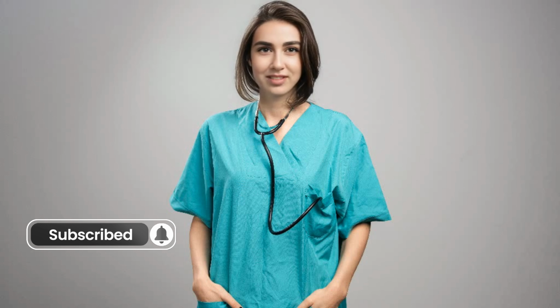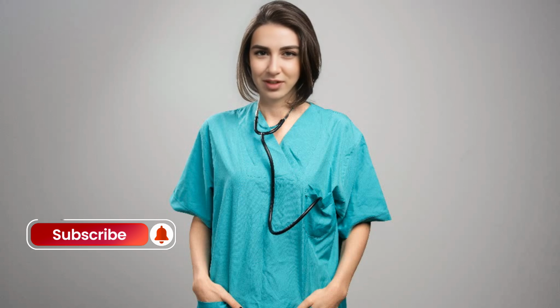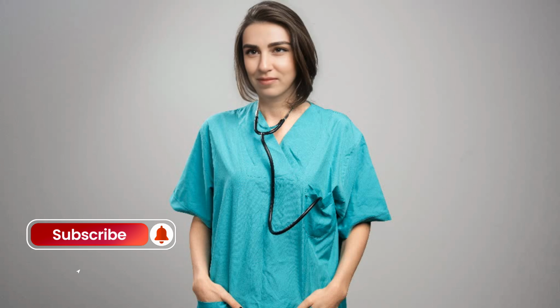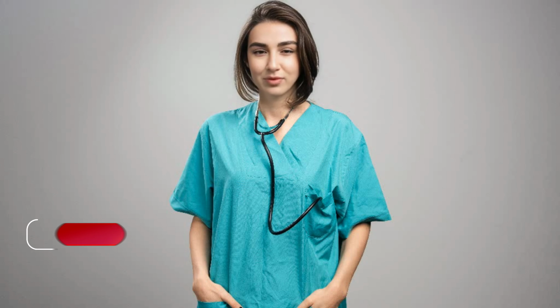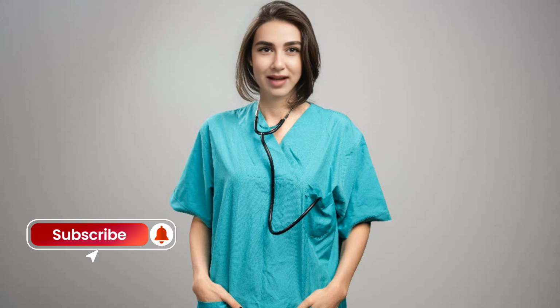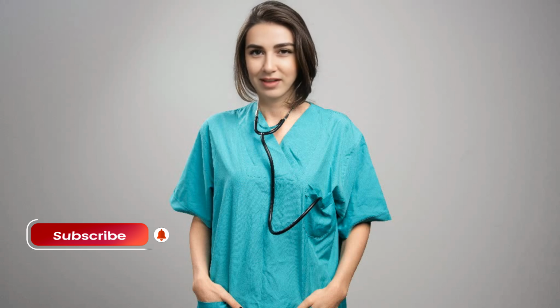Facts about angioplasty. 1. Purpose: angioplasty helps restore blood flow to the heart by widening narrowed or blocked arteries. 2. Minimally invasive: unlike open heart surgery, angioplasty is less invasive and often involves just a small puncture in the skin. 3. Catheter-based: the procedure relies on a catheter, a thin, flexible tube, to reach the affected artery. 4. Balloon and stent: a small balloon is inflated inside the artery to widen it, and often a stent, a small metal mesh tube, is placed to keep the artery open.